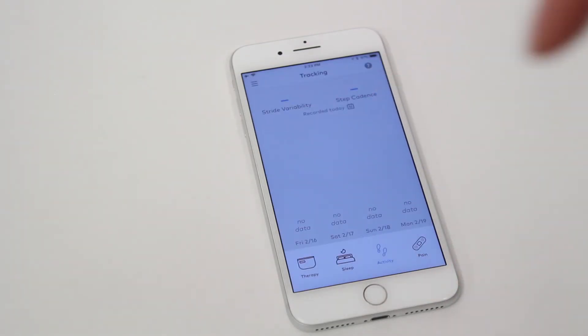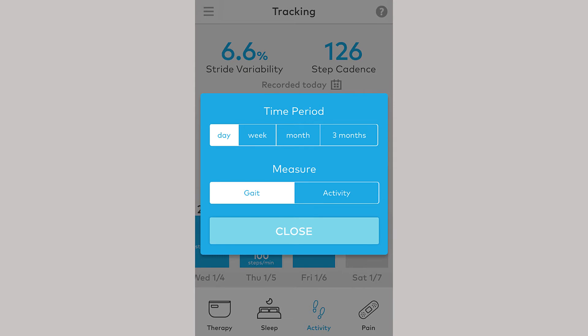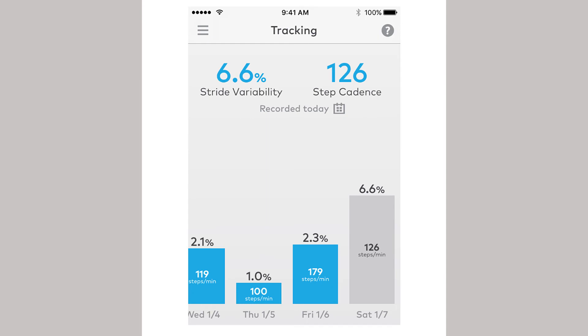You can also select the time period averaged on the screen. Once you have switched the display to gait, your app will show you variability as a percentage and cadence as the number of steps per minute.